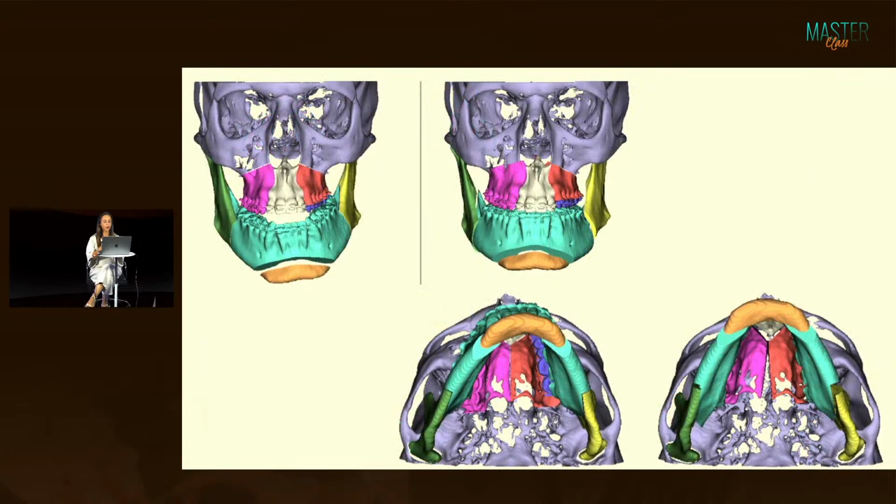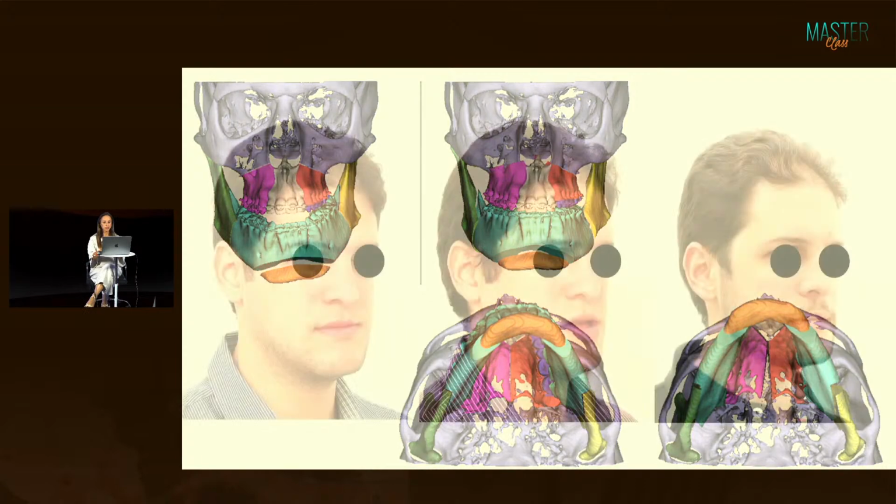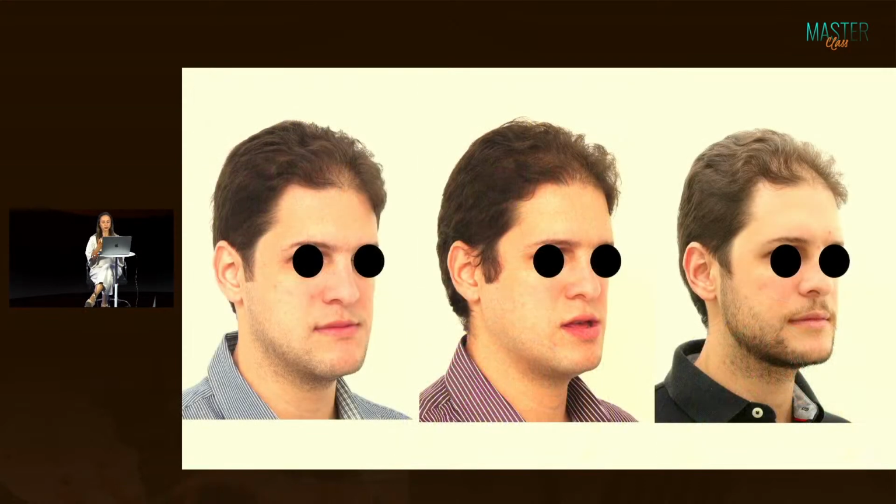This is a very complex case in orthognathic surgery, and we do all this planning very predictably because we are doing all this digital and virtual planning that helps a lot to do this safely.